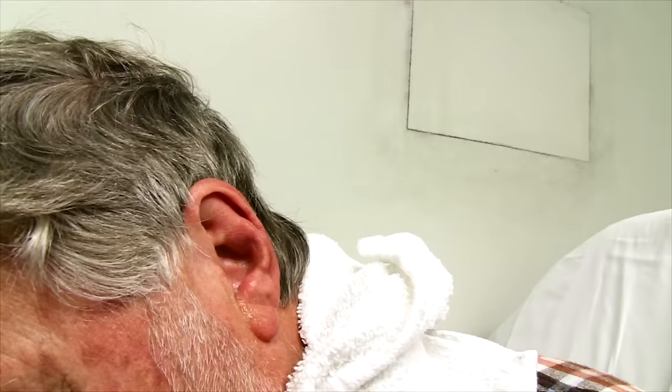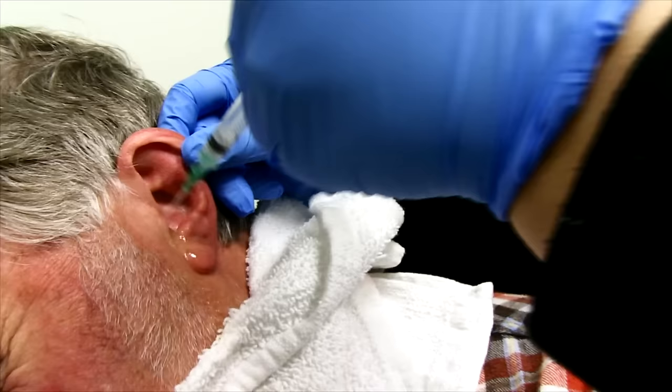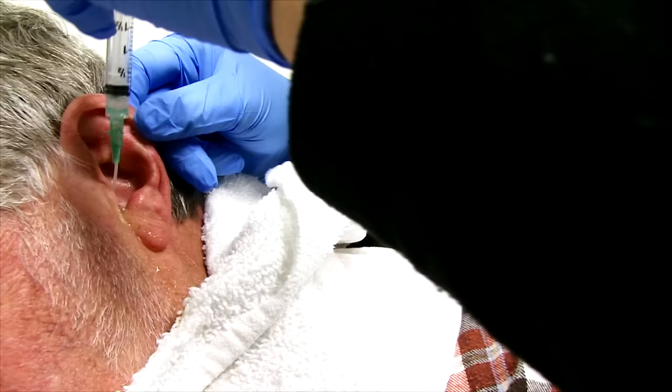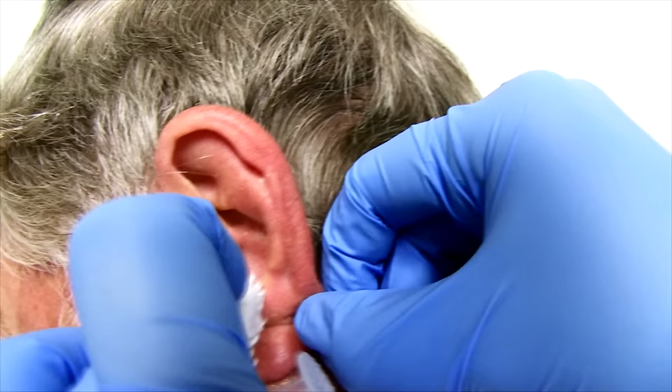The water is starting to not be so clear anymore. Dr. Malik, there's a big chunk right there — it should be coming out pretty shortly. We'll capture this on video. See it right here? There it is — it's working. That's it all come out. So that's probably the big chunk of it.